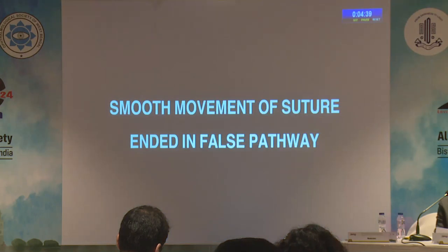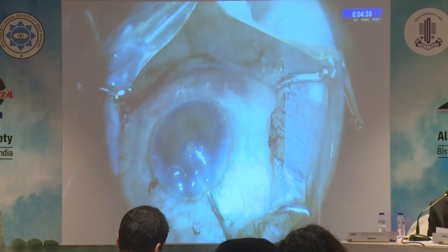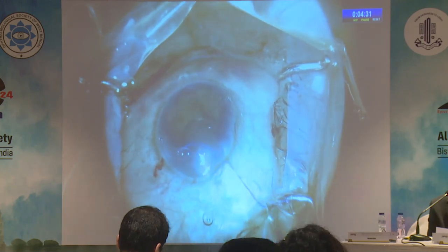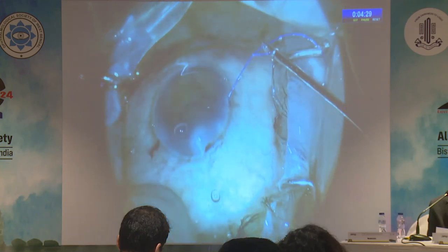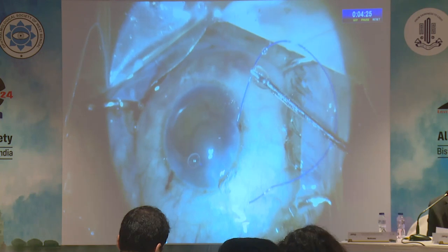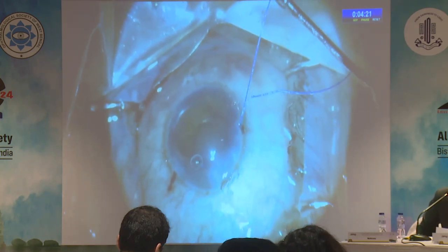The smooth movement ended in a false pathway. Smooth movement is not enough to confirm that the suture is on the right track. The procedure continued unnoticed despite the resistance encountered after a few passes. It ended in false passage, and the suture was visible through the pupillary area when releasing it.